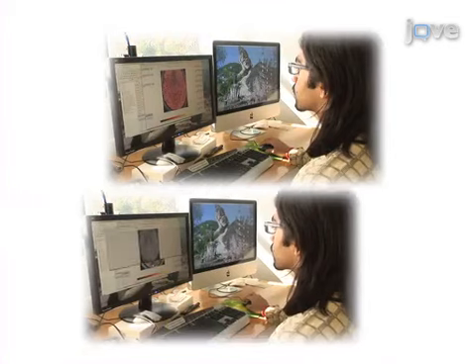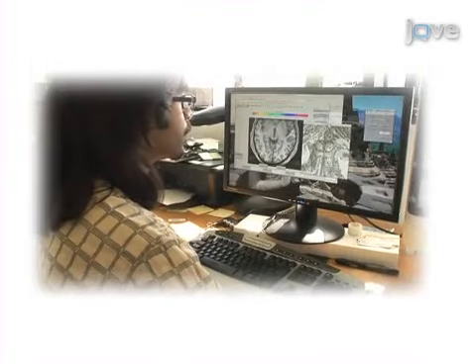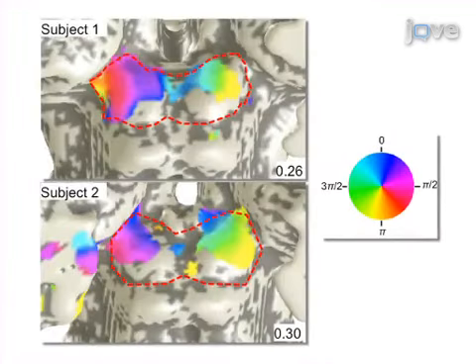And the data is analyzed using a combination of standard and surface-based analysis techniques. The final step is to overlay the data on a 3D surface representation for visualization. Ultimately, high-resolution fMRI is used to show a topographic representation of polar angle to visual stimulation in human superior colliculus.